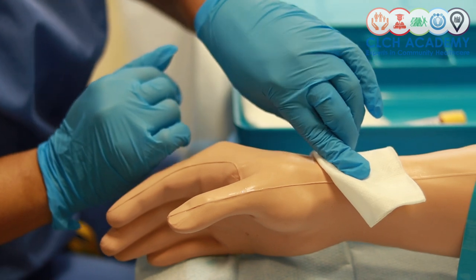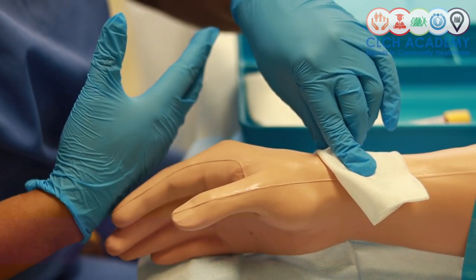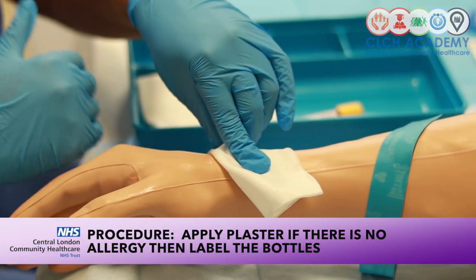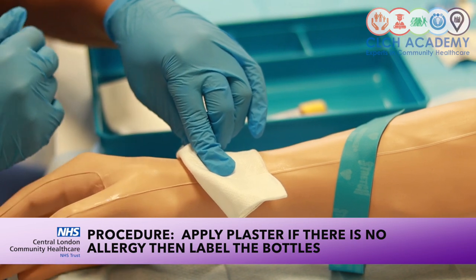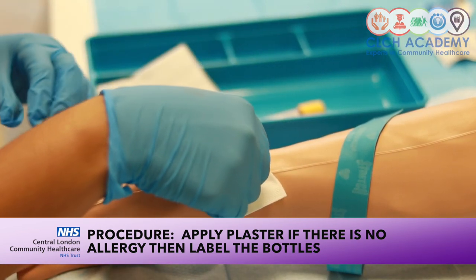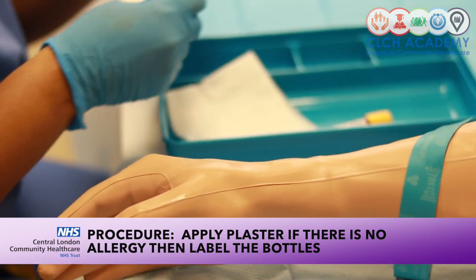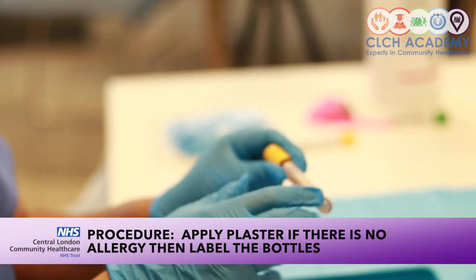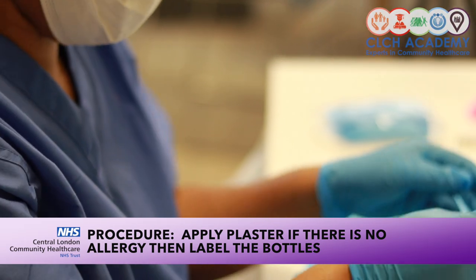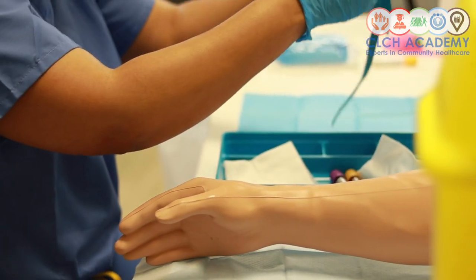Applying a little pressure, inquiring of my patient whether they have allergies to elastoplast or plaster. If the answer is yes, then I might opt for a different dressing. However, if the answer is no, I'm just making sure that they're not bleeding and I'm applying the elastoplast after that. I can then label my bottles, confirming the patient details at the bedside and send them off to pathology. That brings us to the end of that session.